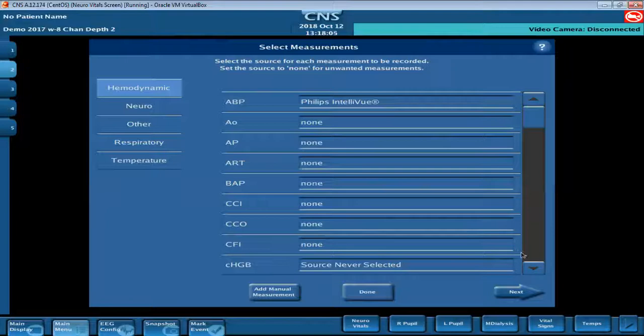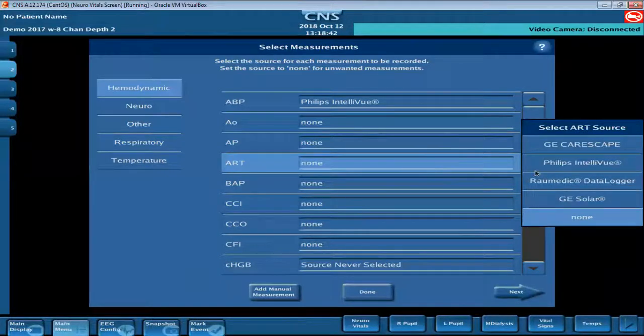So it won't be collected. And this has really been, like, I was just in a site yesterday, and because in the NICU, we might call something ABP, and everything ties back to your device, your bedside device labels. Sometimes we might choose ABP as we start a blood pressure on a baby, but sometimes we choose ART, or if we've switched to a peripheral ART line, we might get rid of UAP, so an umbilical arterial line, and switch. And so what happened for this one patient is we'd never enabled ABP. We'd only ever had ART and UAP, but the nurse had selected ABP and the trend wasn't visible. And so they couldn't figure out why.